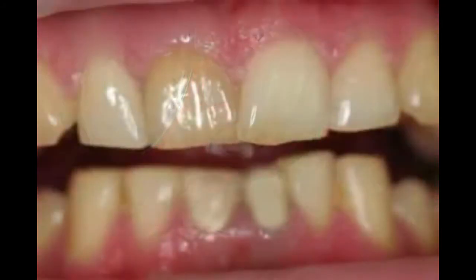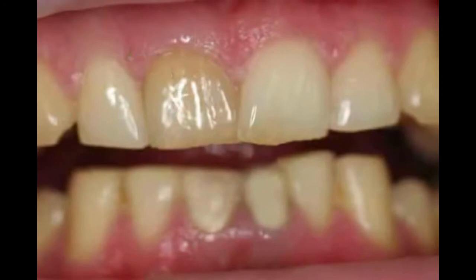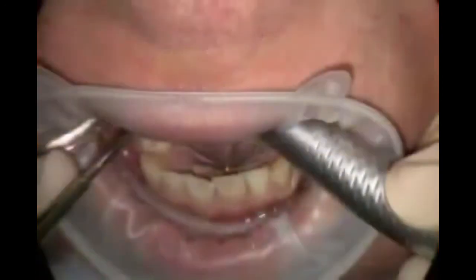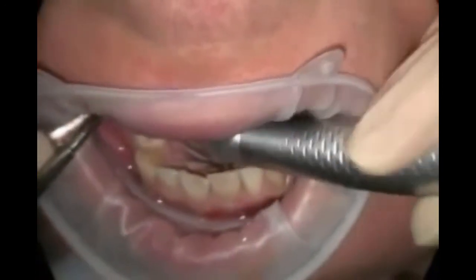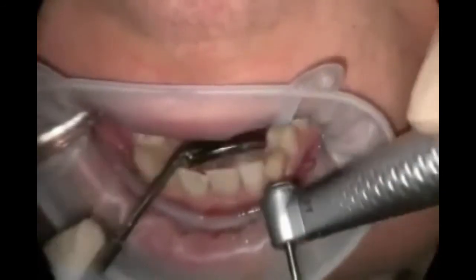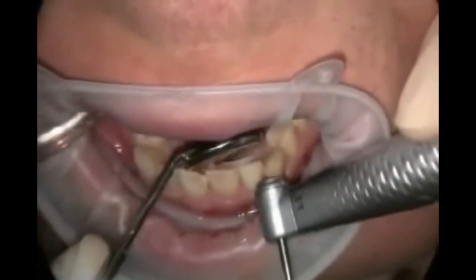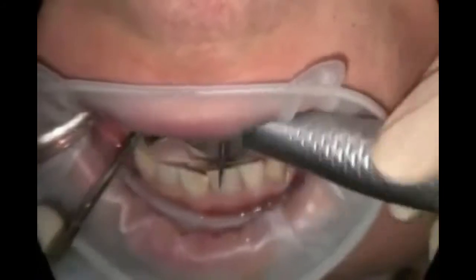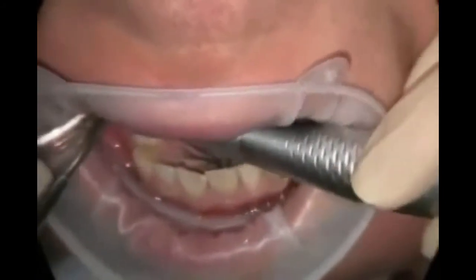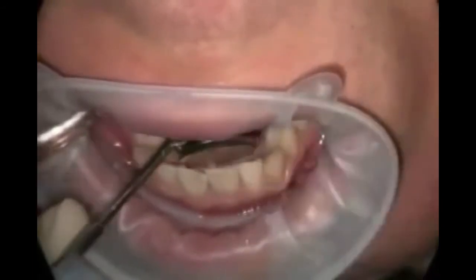Here you see a patient with a dark upper right incisor. Years ago, he took a fall, and the root of the tooth was not properly treated. As the years passed, the tooth became discolored. The root canal treatment had already been renewed once in an earlier session. Now the tooth is opened once more from the rear, the same opening as in the root canal treatment.